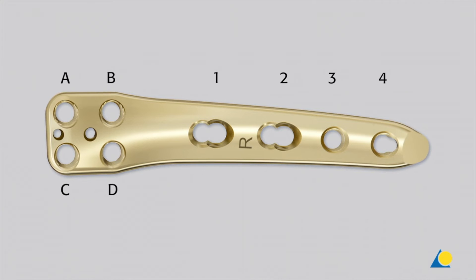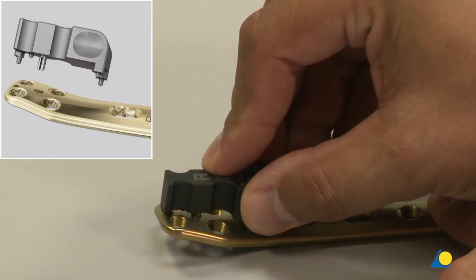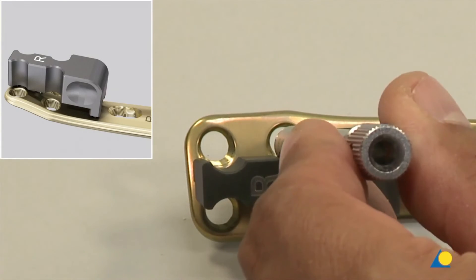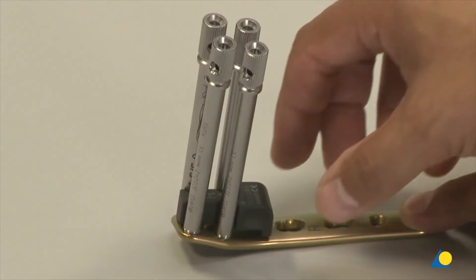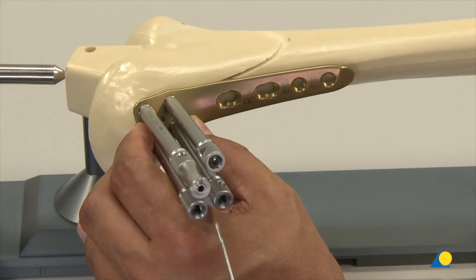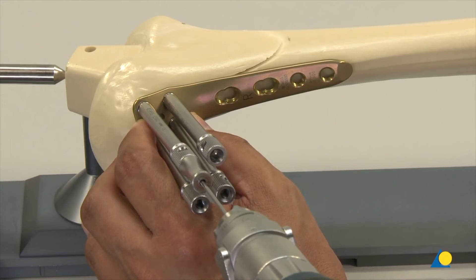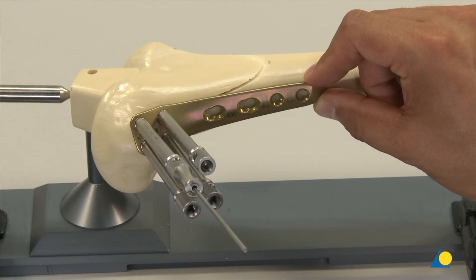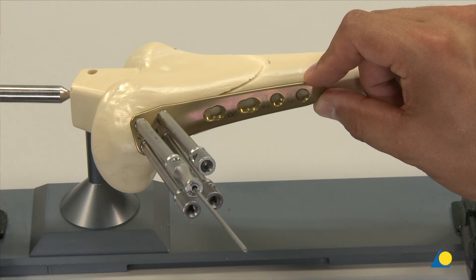It should be ensured that the correct implant is selected. The guiding block is used to align the drill sleeves on the distal part of the plate. The drill sleeves are inserted and the guiding block is removed. A 2.0 mm K-wire is inserted through the centering sleeve in plate hole A to temporarily secure the plate. It is important that the plate position and the trajectory of the K-wire is checked with the image intensifier. The K-wire must not exit the condyles posteriorly. If necessary, the plate position or sagittal tilt is modified.